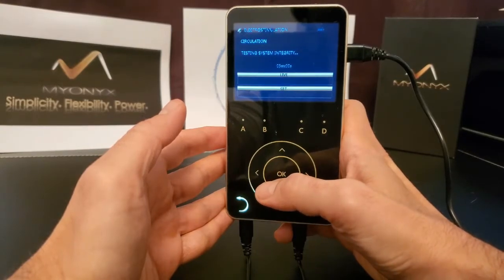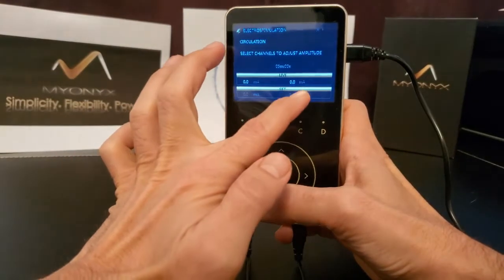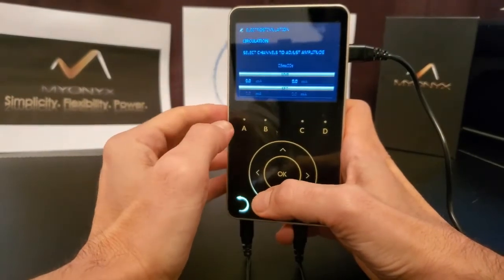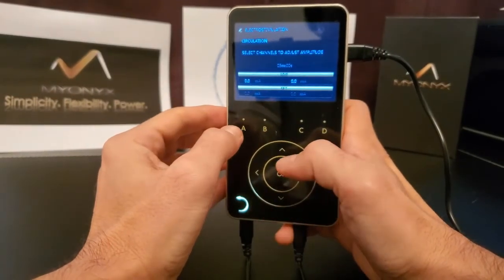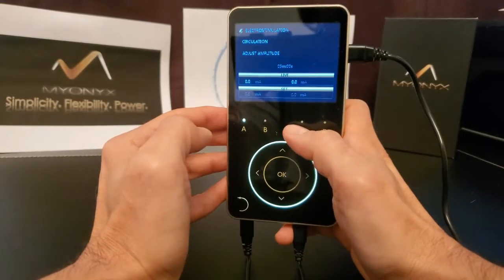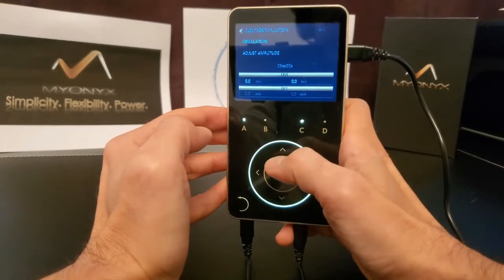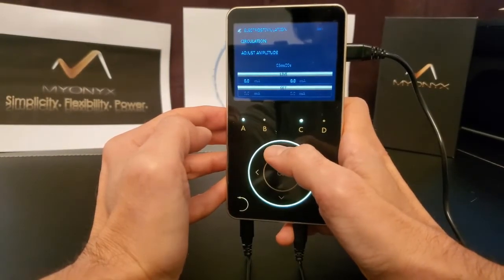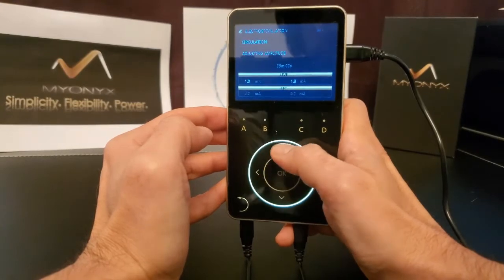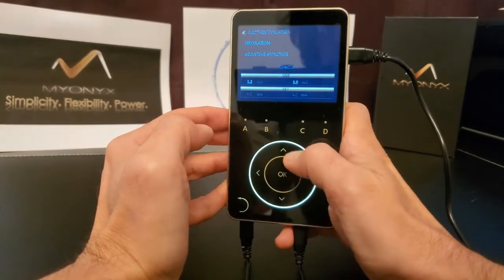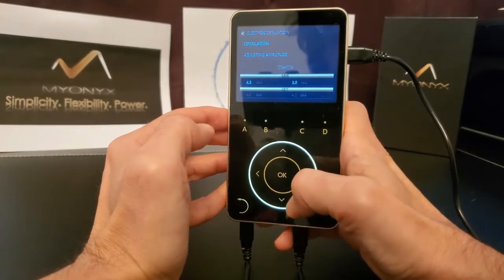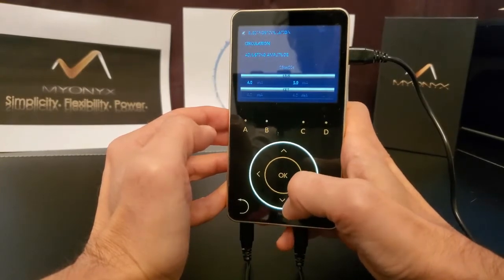Connected channels will appear enabled in white. To adjust amplitude on connected channels, select the letter representing the channel. You may select one or more channels at once. To adjust the amplitudes, use the up and down arrows or use a circular swipe motion to increase or decrease amplitude in connected channels.